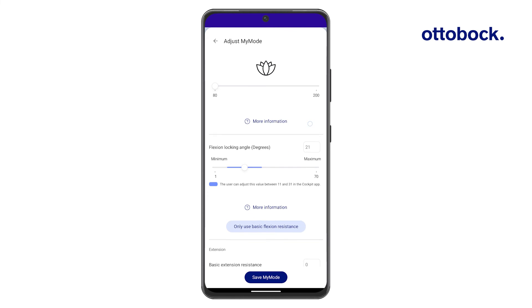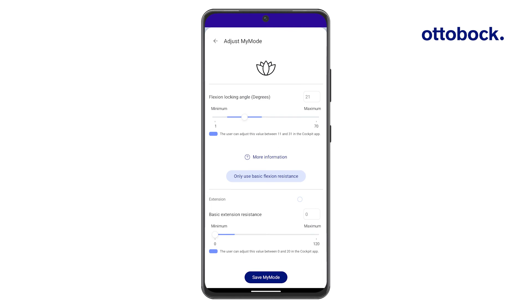Because it's not possible to test all MyModes in a clinical environment, users can adjust parameters if needed. The blue bars on the slider indicate the range in which they can make adjustments.